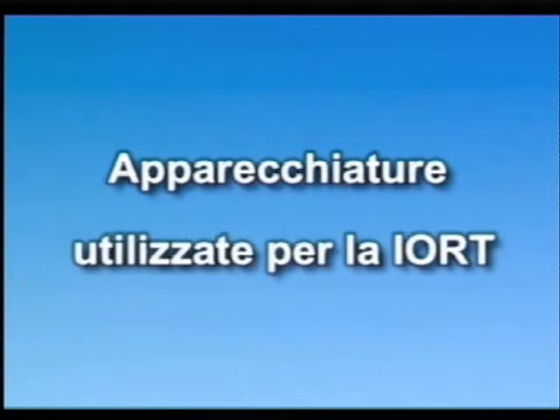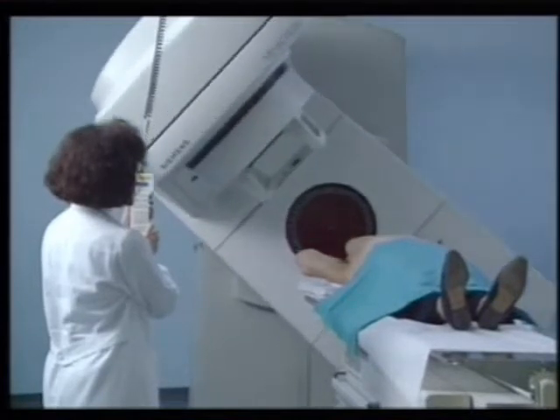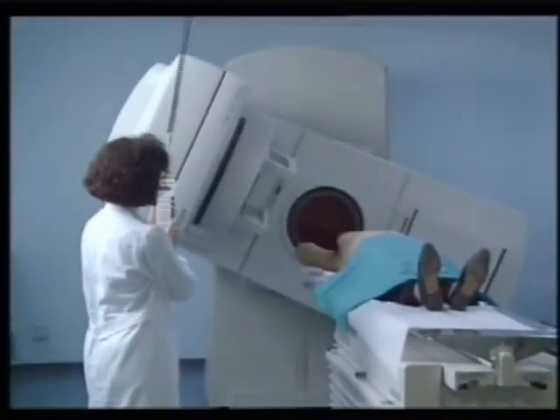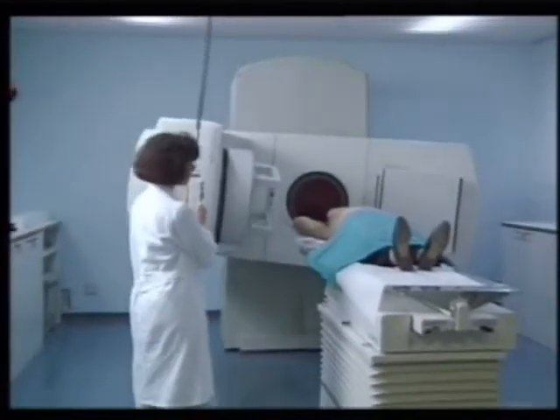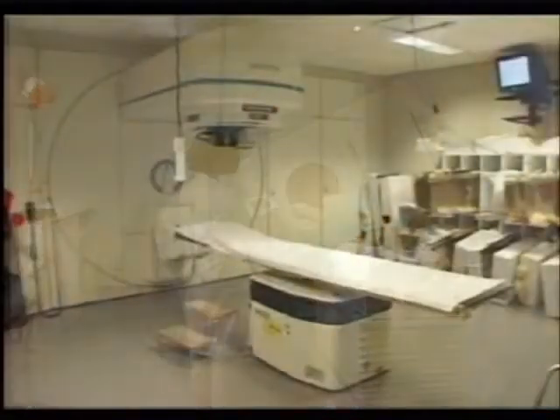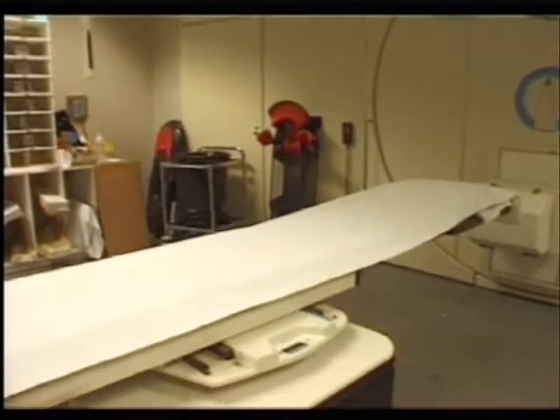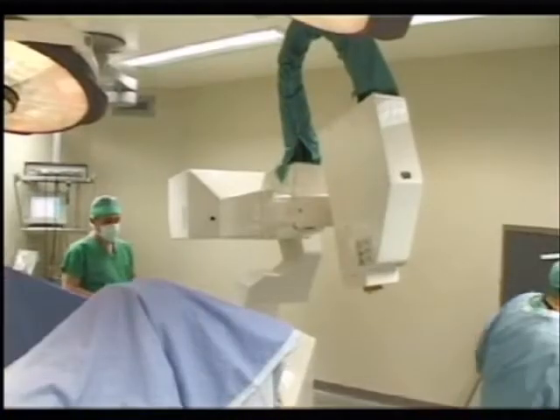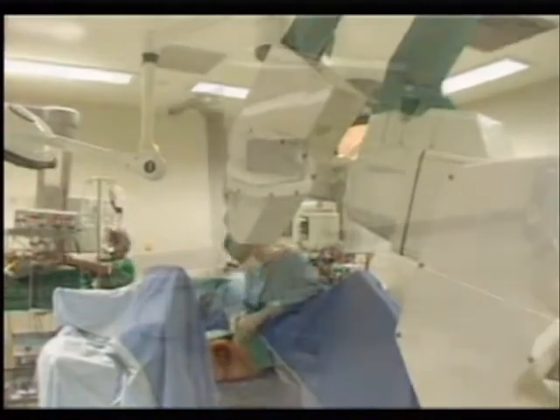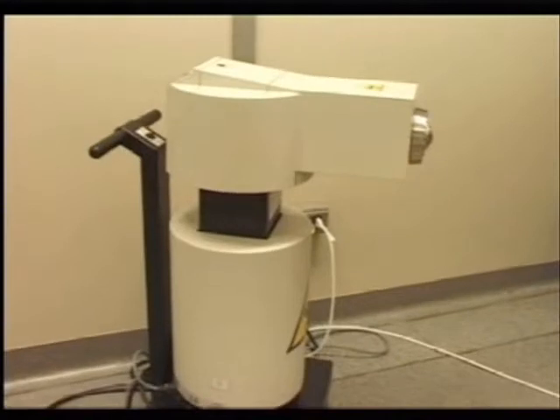To perform intraoperative radiation therapy, it is possible to use different types of equipment, namely traditional linear accelerators, which may deliver electron beams approximately ranging between 4 and 15 MeV, or linear accelerators installed in a dedicated bunker containing both the accelerator and the facilities of an operating room, or dedicated mobile linear accelerators such as Novac 7, or high-dose brachytherapy units using sources of iridium-192.